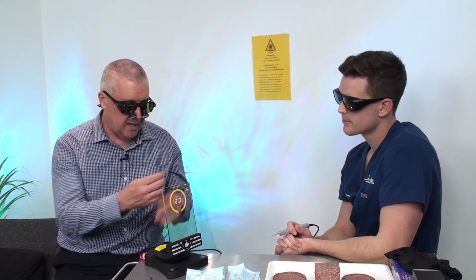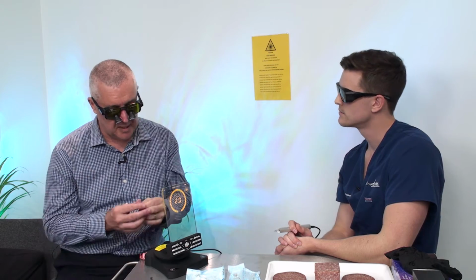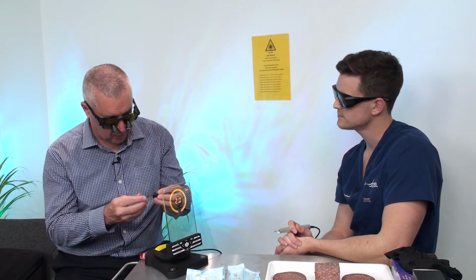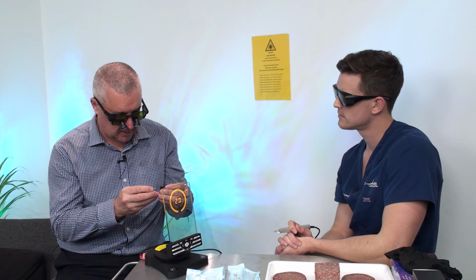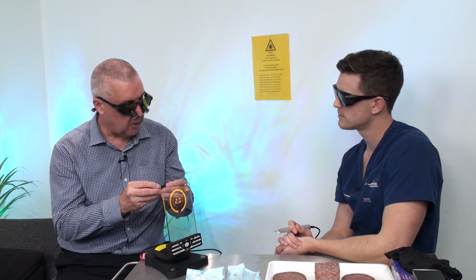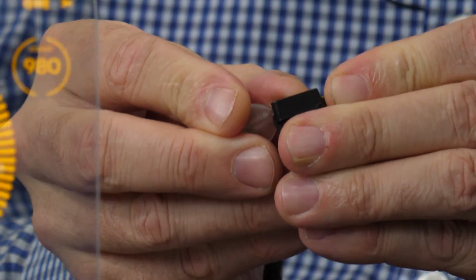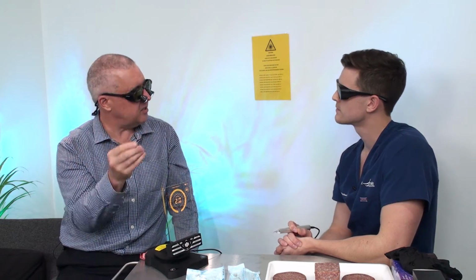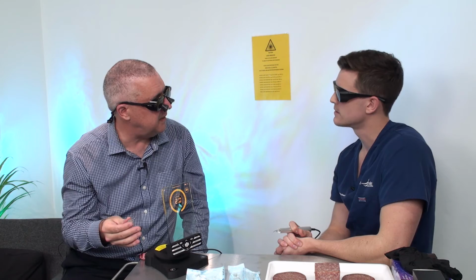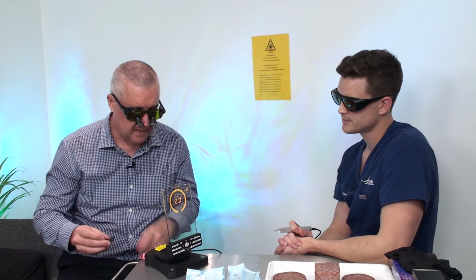One of the interesting things with this laser is the tips out of the box actually come straight, but then you can bend them. There is a tip bending tool, and people can also bend them by hand, but there is a wonderful little bending tool where we can place the tip in and then just slide it back to bend it to the right angle like that, so it reduces the risk of breaking it. That makes the instrument much more like a contra angle. I find it feels more natural to me when I'm holding it. Yep, I'd agree. That's good.